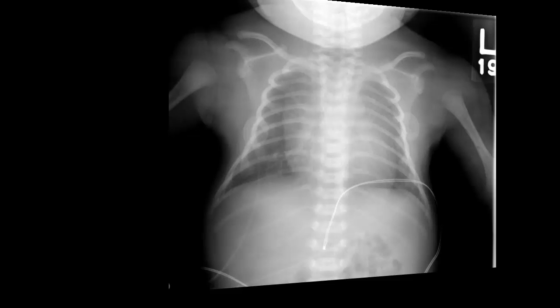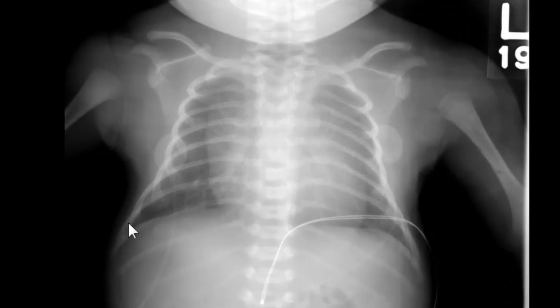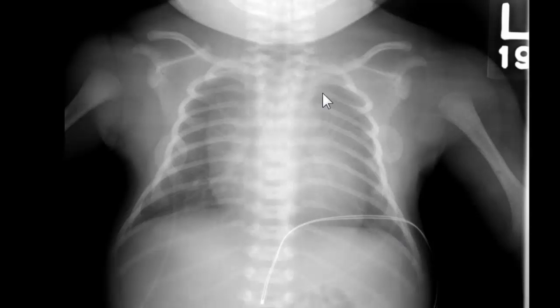This is another normal chest. The lungs are fairly symmetrically aerated, normal cardiothymic silhouette, and there's the ductus bump — another normal neonatal chest.